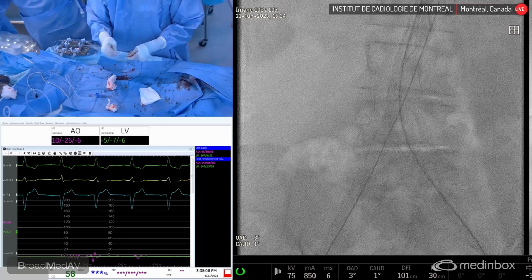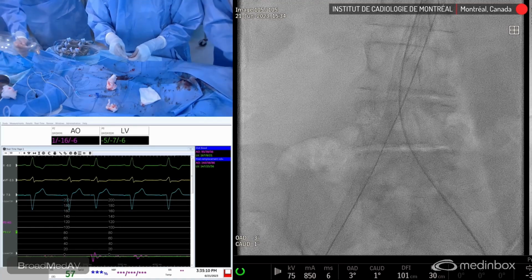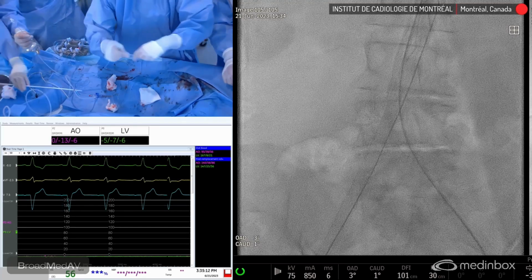So use a mammary catheter to cross over. We'll get our crossover access before we close the MANTA.